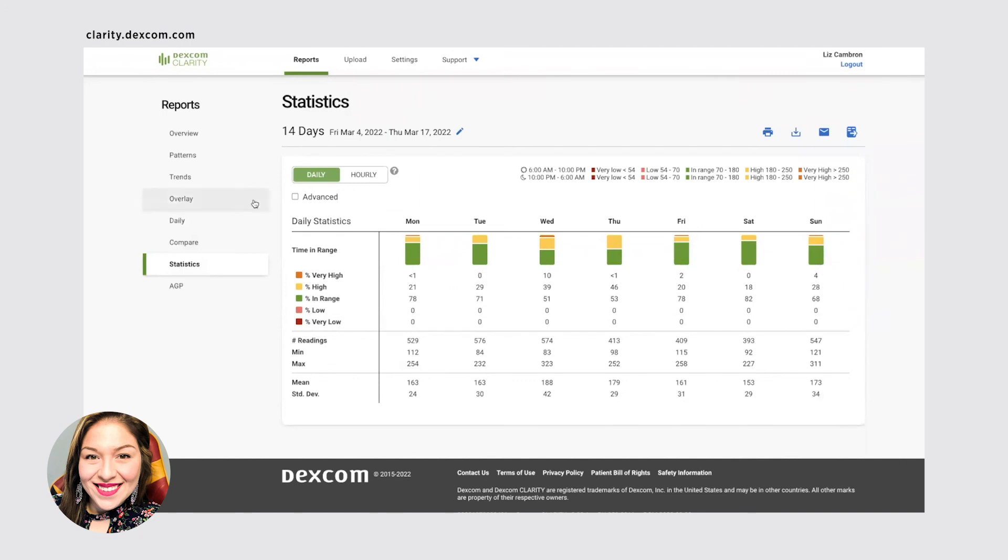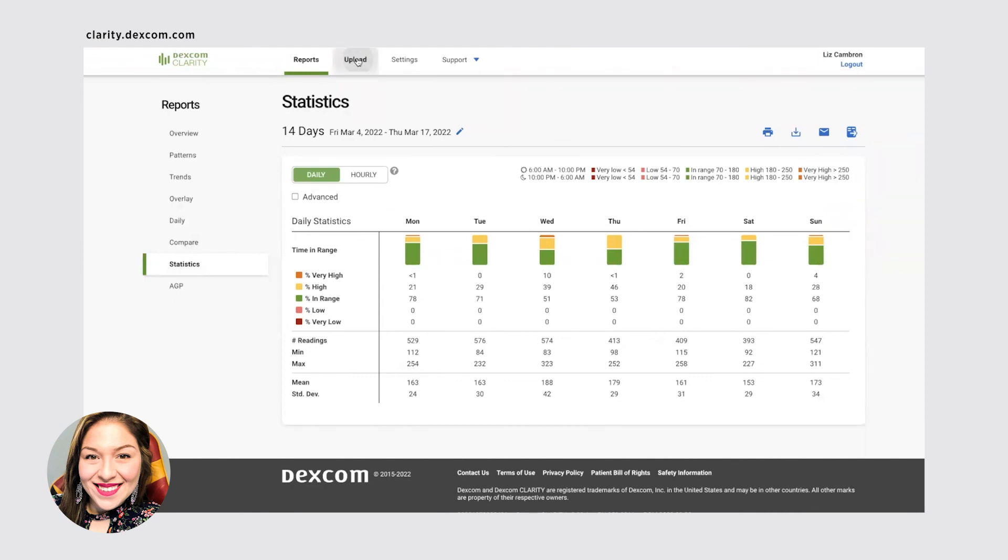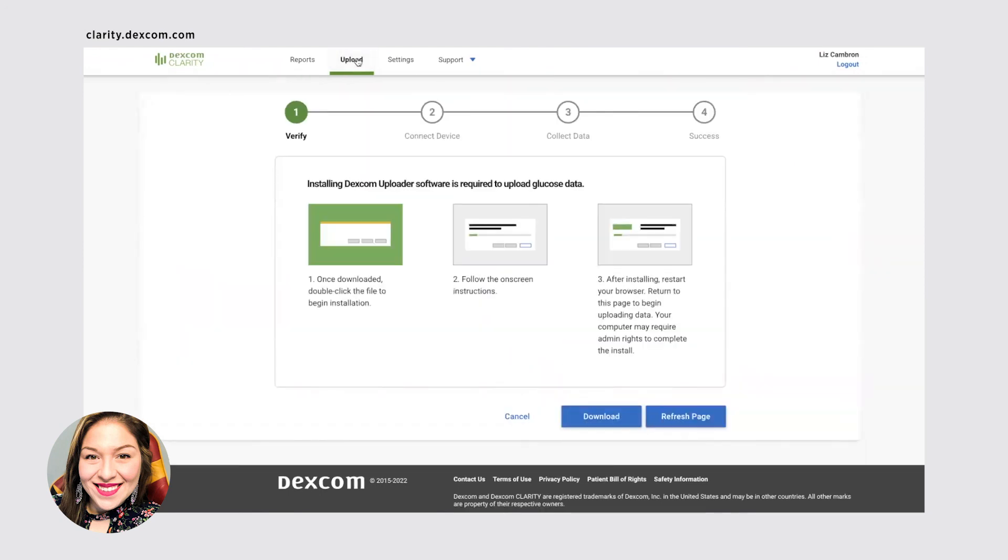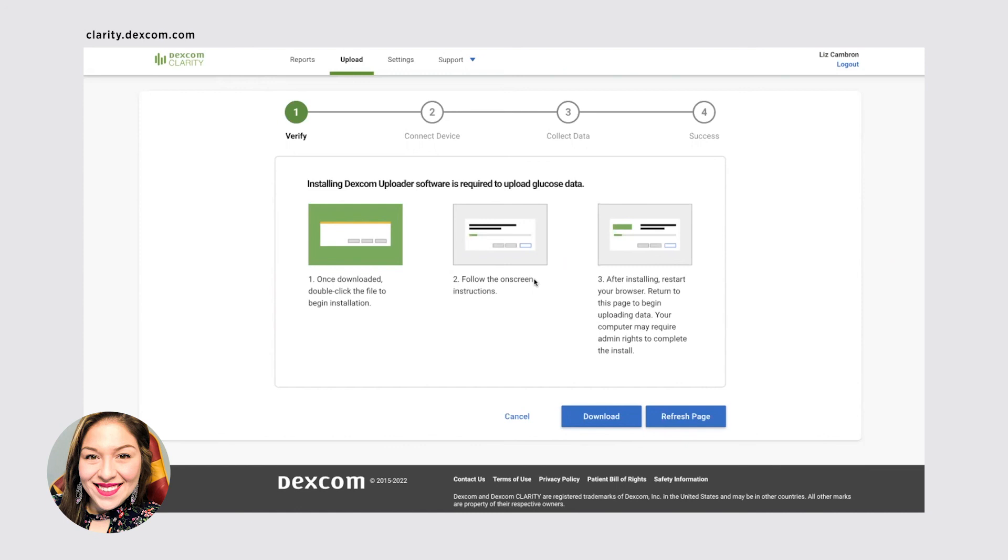This is kind of the report section of the online desktop app. This is also where you can upload. So you would download a software. This is on a Mac. So for a PC and HP, this might look slightly different, but you'll plug in your Dexcom G6 monitor and be able to plug it into your computer. And with the software, it'll automatically upload your data to your website. So you'll see it in your report section.